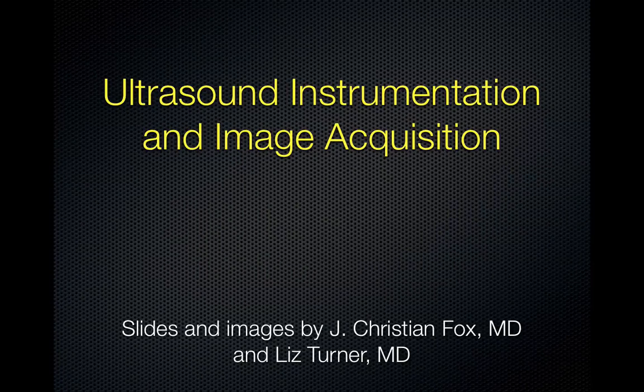Ultrasound instrumentation and image acquisition. Special thanks to Chris Fox of UC Irvine for providing many of the images.